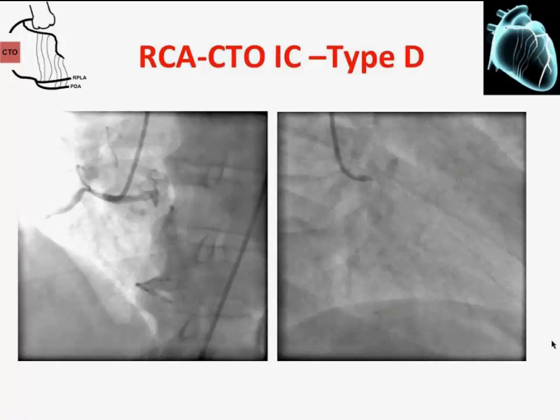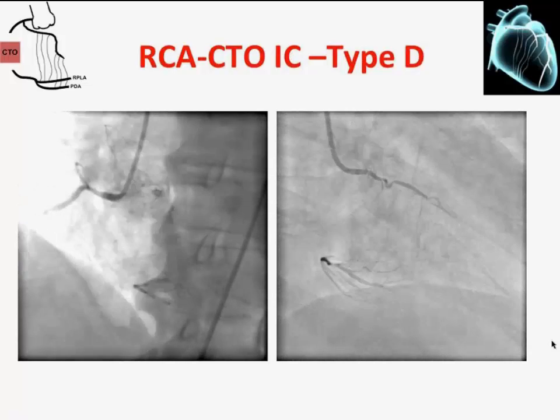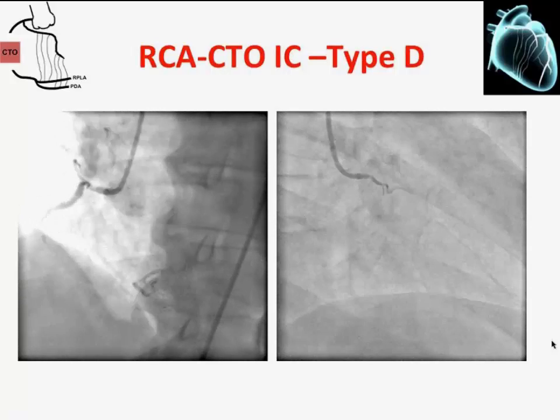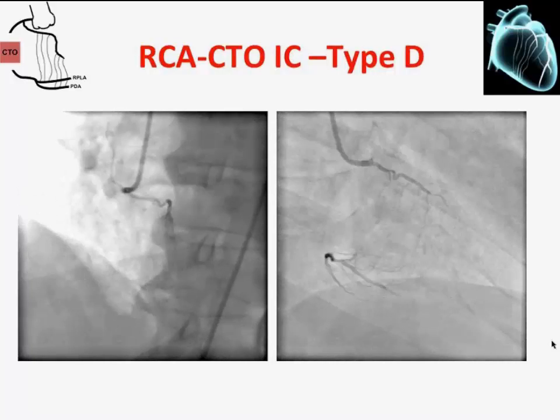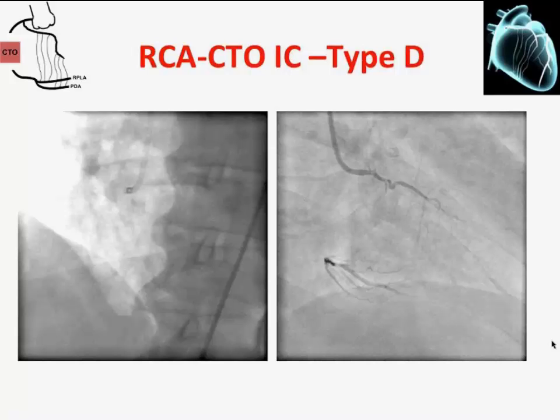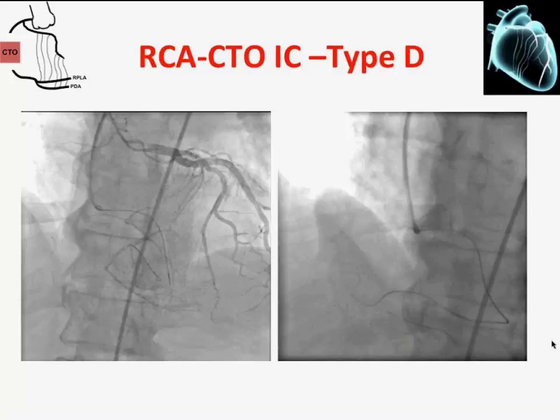So this is a ping pong case, and I can also tell you the reason. As you will see here, this is what I call a septal connection, a right-to-distal septal artery to the distal RCA. So it was not very difficult to pass this, and then I could also bring the Corsair down.